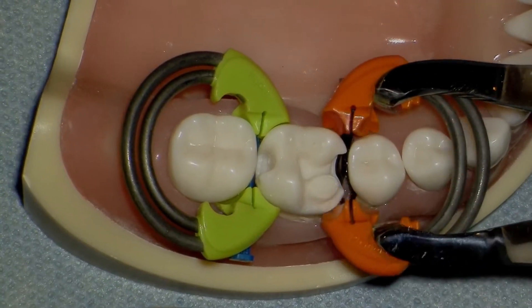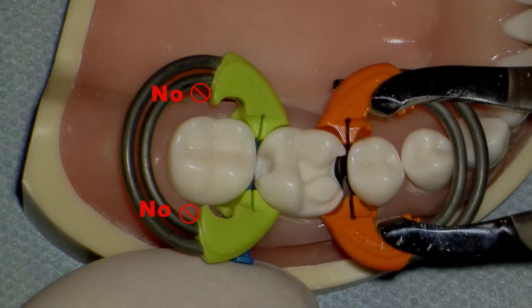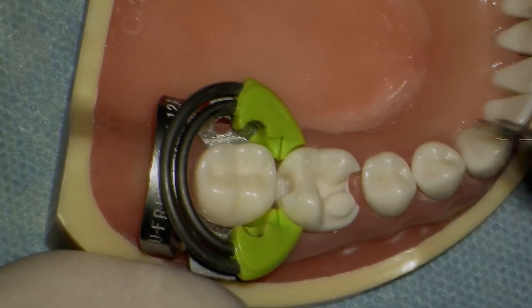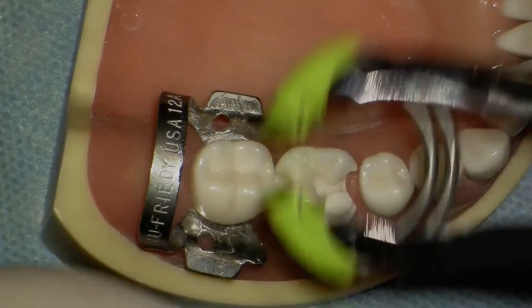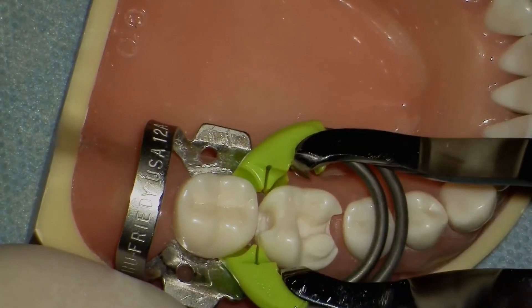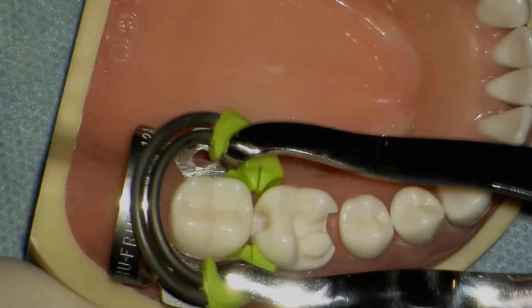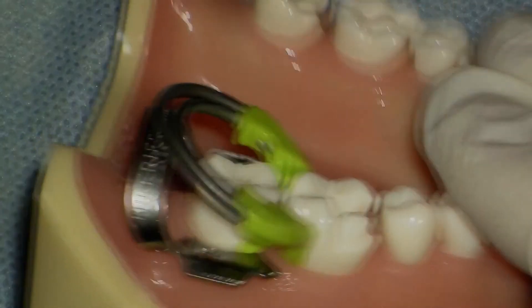When placing the dual-force separator, make sure to place the designated forceps on the resin portion, not the metal portion. Also, only use the designated dual-force forceps — otherwise, you will have impaired function of both the ring and the forceps. Many clinicians use rubber dams and rubber dam clamps. They have complained that it is difficult to place traditional separators near the clamp because the spring runs into the rubber dam clamp. One of the nice advantages of the dual-force separator is the angle built into the springs that allows it to fit on top of a rubber dam clamp in most instances without significant interference.